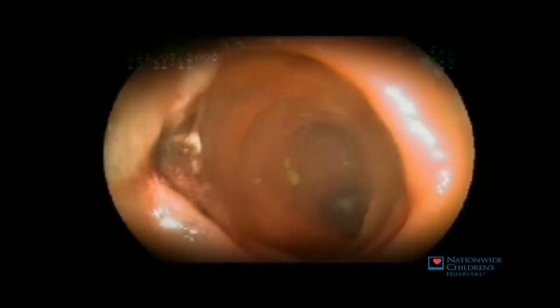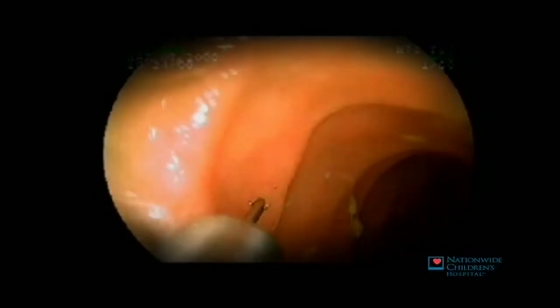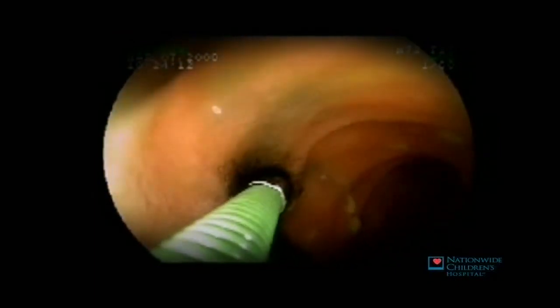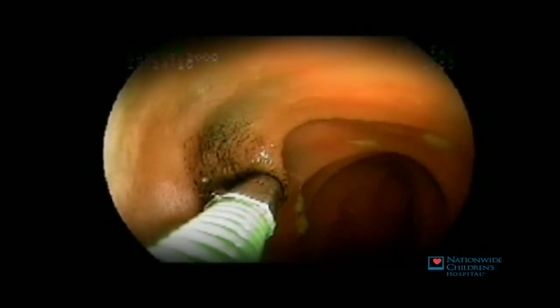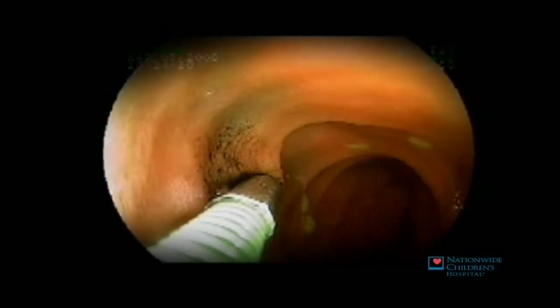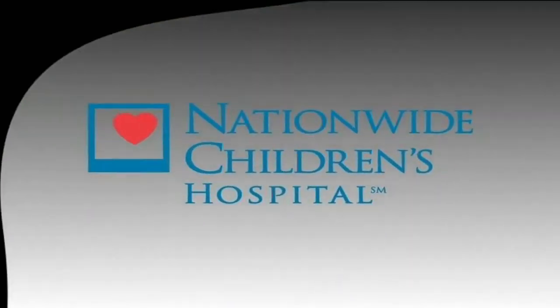This leaves a clean, sealed base where the polyp used to be. We'll then go back and retrieve that lesion for examination under the microscope, and then again label this as our farthest point by leaving a small permanent ink mark, or tattoo, at the wall of the small intestine.